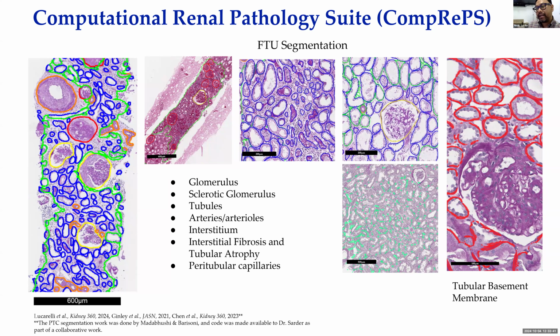I wanted to understand from histology the interaction between cell and tissue to have a fundamental understanding of human biology using AI in a big data context. That's the central theme of my lab and my career. We wanted to expand into other tissue types, and we'll show some results where we are going and bringing more and more biology to make fundamental contributions using these tools. So that's why this tissue segmentation is important.